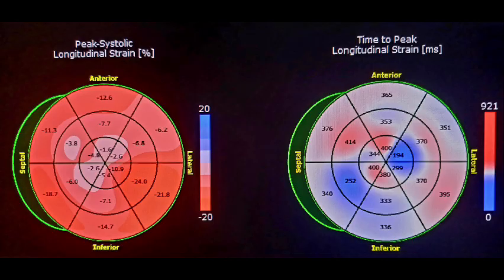So this patient is from a family of 8 siblings. They all have a condition called Danon disease. Danon disease is an infiltrative cardiomyopathy that can cause Wolff-Parkinson-White, but can also cause hypertrophic cardiomyopathy as well. She's lucky because we picked it up early before it manifested into hypertrophic cardiomyopathy, but she has subclinical disease already. So GLS was helpful here because yes, she might need the EP and all that, but ultimately she needs a heart transplant, and that's what we're working her up for at the moment. So we're referring her to IJN soon.